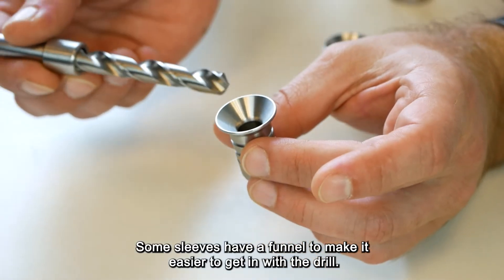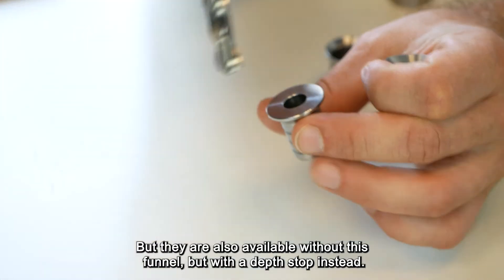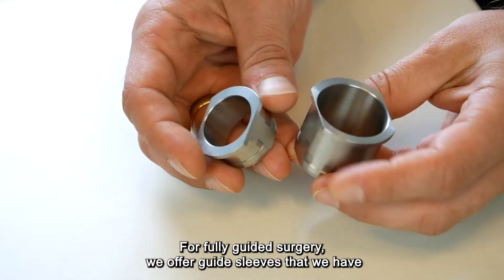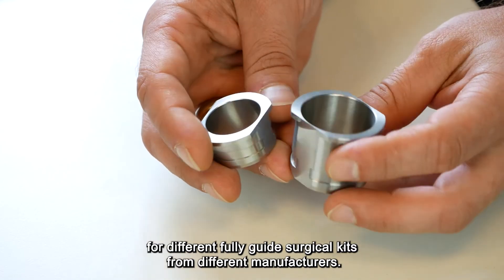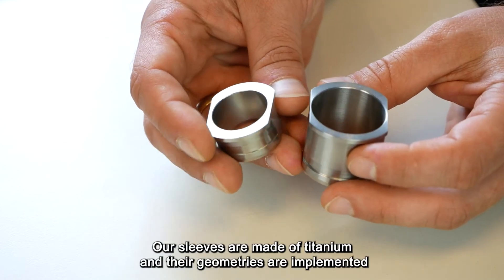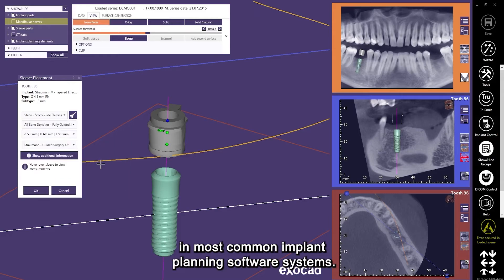Some sleeves have a funnel to make it easier to get in with the drill, but they are also available without this funnel, but with a depth stop instead. For fully guided surgery, we offer guide sleeves for different fully guided surgical kits from different manufacturers. Our sleeves are made of titanium and their geometries are implemented in most common implant planning software systems.